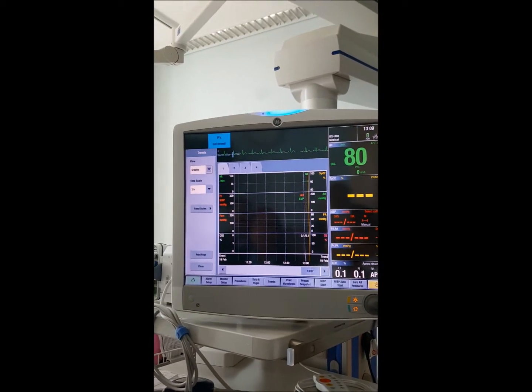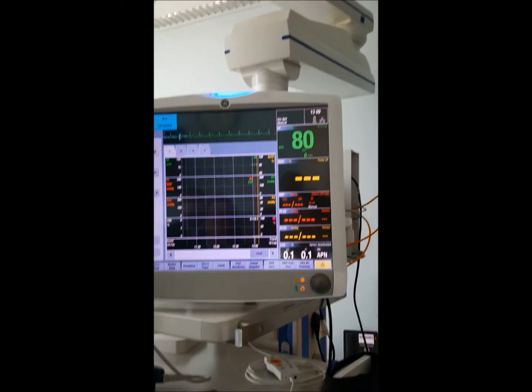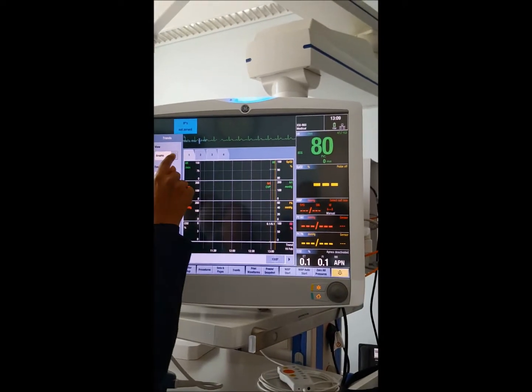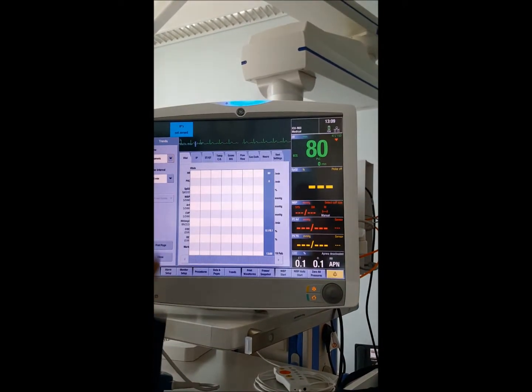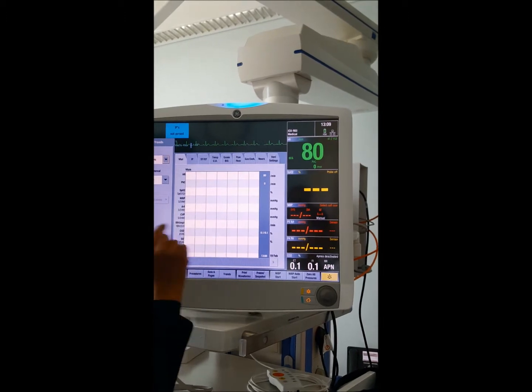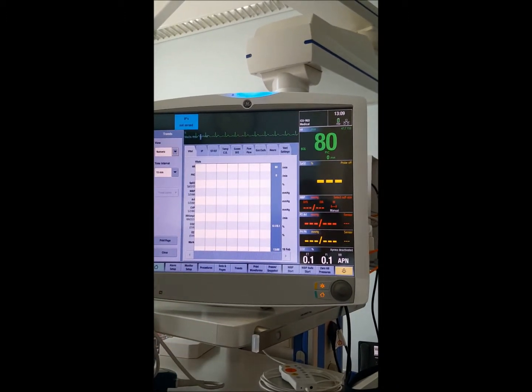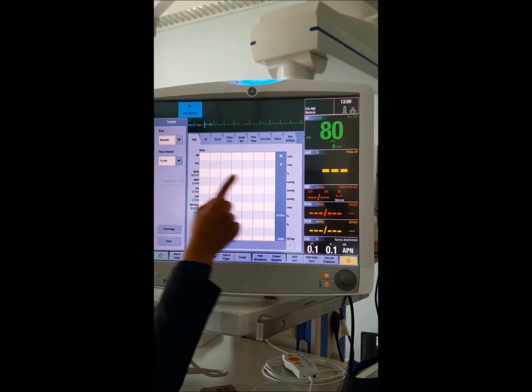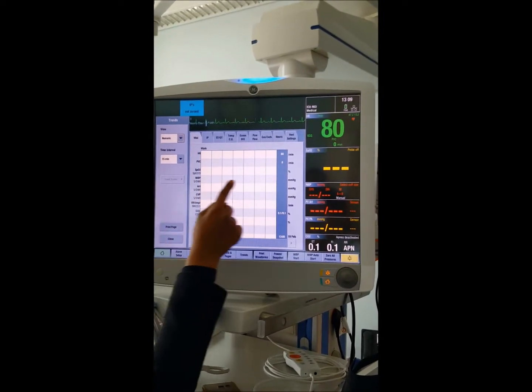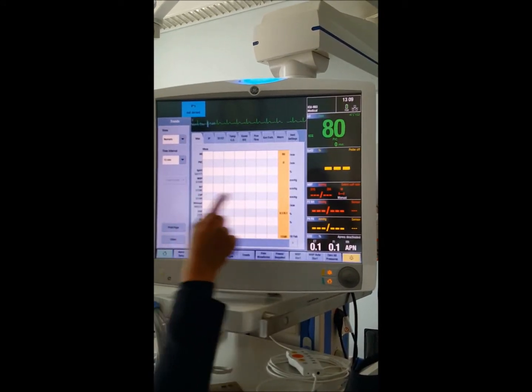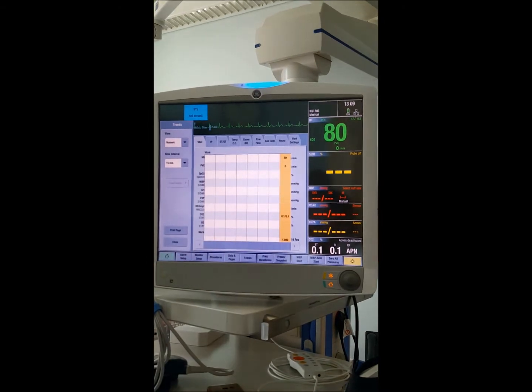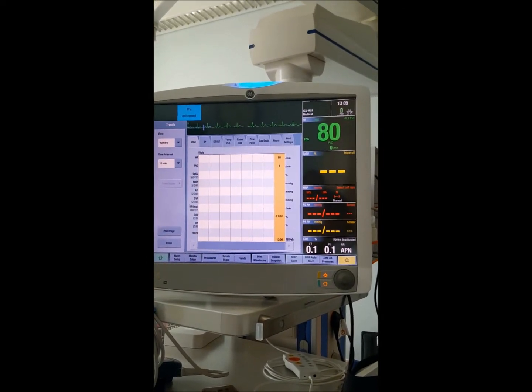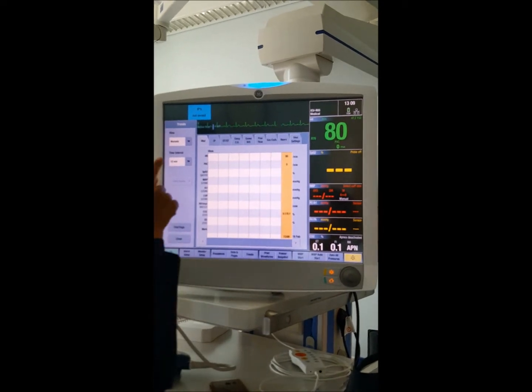For nurses, you are more interested in numerical data — for example, what was the heart rate at 7 AM. Change the view to numeric and it will display a tabular form with only numbers. Heart rate, NIBP, CVP, arterial measurements, CO2 measurements — all history is stored here with timestamps.